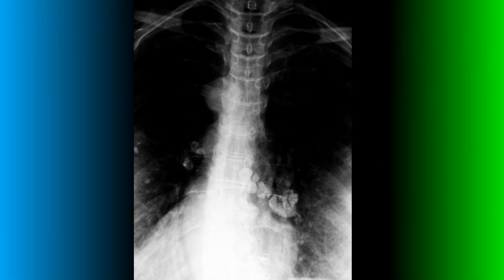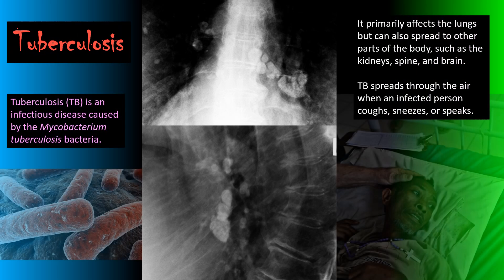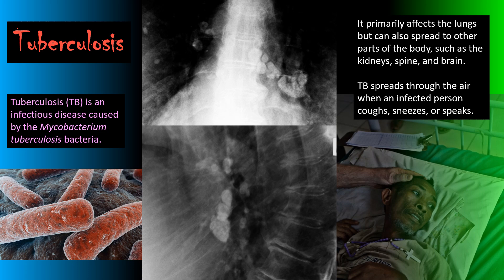On this frontal view of the thoracic spine, we're looking at one of the more common lung pathologies seen on x-ray. These multiple areas of soft tissue calcification are due to a previous exposure to a granulomatous disease — in this case, tuberculosis.